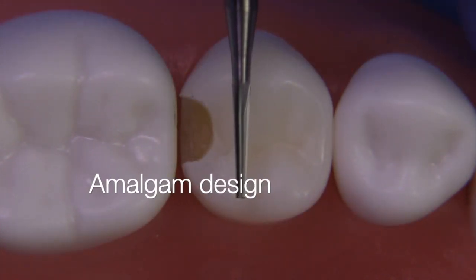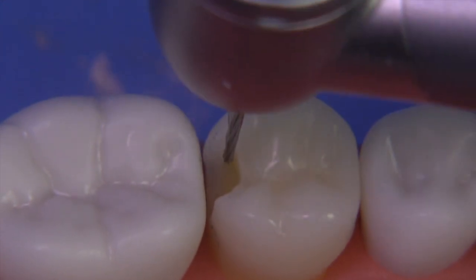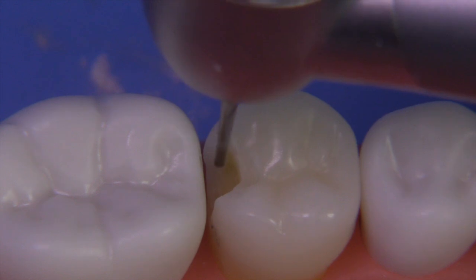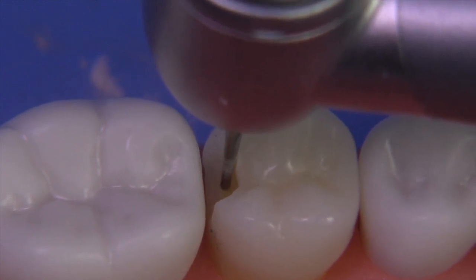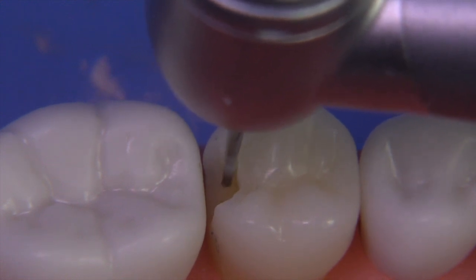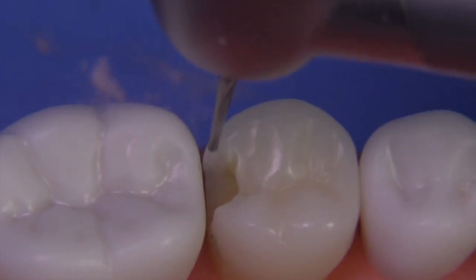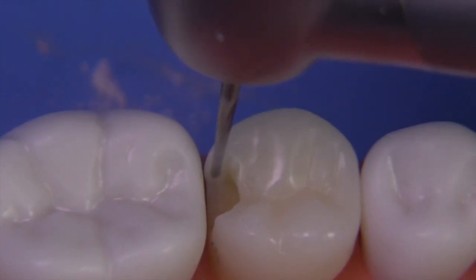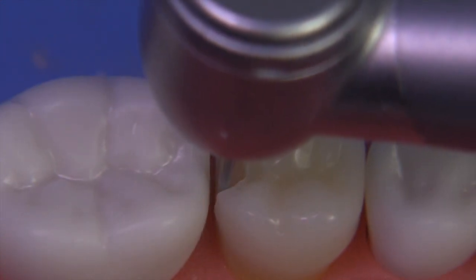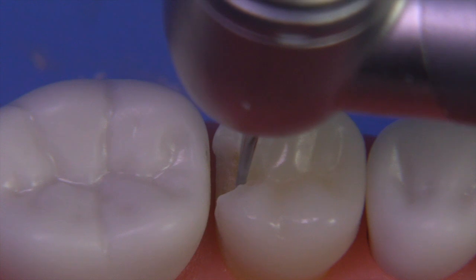Today we're going to convert this to an amalgam design, and for that we need to create more retentive form. We'll use a 169L carbide to accomplish the sharpening of internal line angles and ultimately develop retention grooves that extend from the gingival all the way to the occlusal. The 169L works very well in a prep like this — it's long with a small tip and not very efficient at cutting, so it tends to be quite safe. Use it more for the walls themselves, removing them to the point where it's easier to then use the hatchet to plane the axial, lingual, and facial walls.